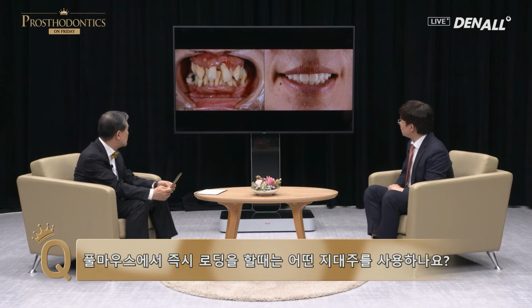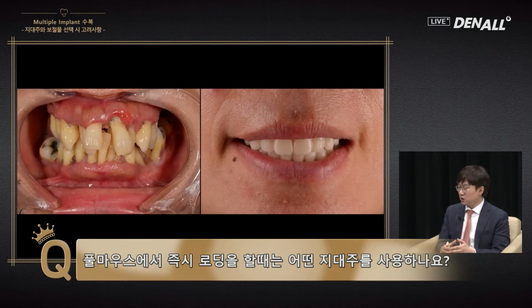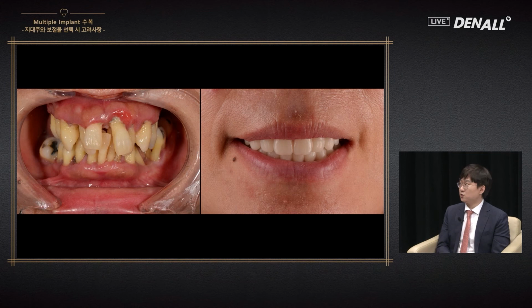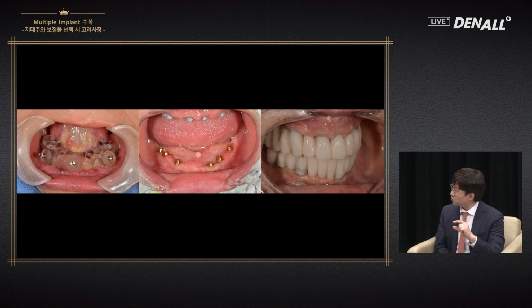This is a case. This patient came to me. For a full mouth, what is important is the denture. The teeth are extracted, and the appropriate denture should be used for appropriate positioning of implants. So CT is taken for appropriate implant positioning. Did you do the guided surgery? Yes, I didn't do the surgery, but we used guided surgery. Multi-unit abutments with a 3 or 4 millimeter collar. A scan body appropriate for that existed.